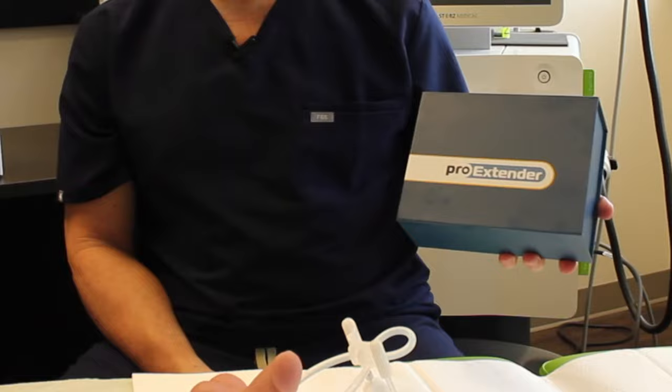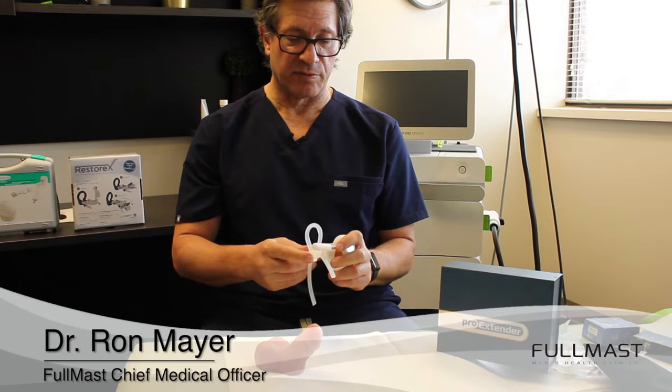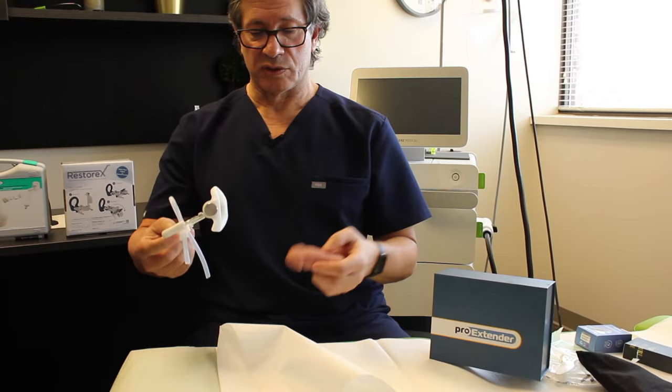The first device I'm going to demonstrate is the ProExtender. It comes in parts including additional extenders. Once you have decided on the appropriate length for your penis, you couple the two pieces together.